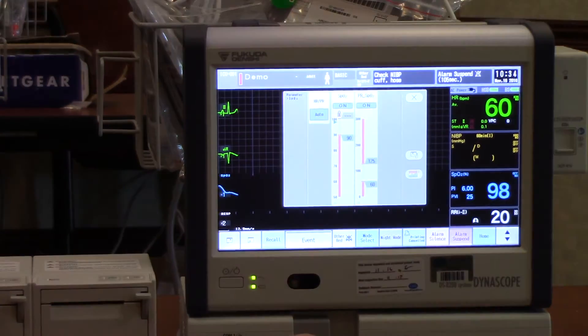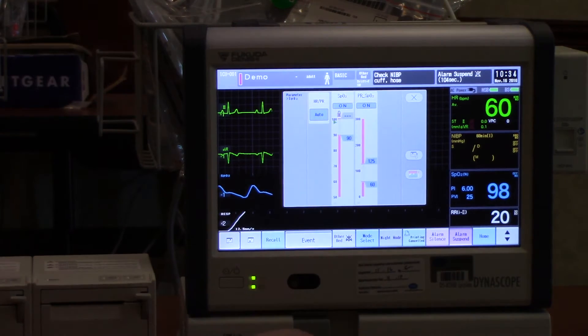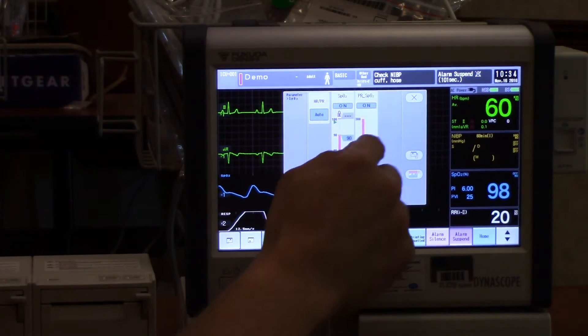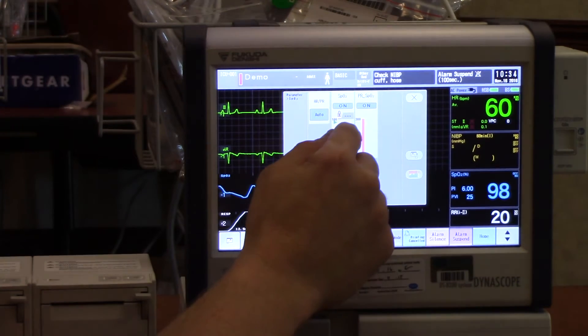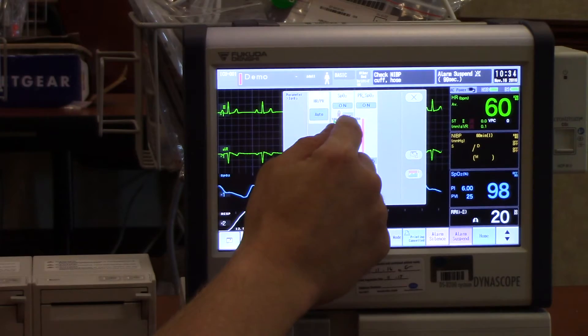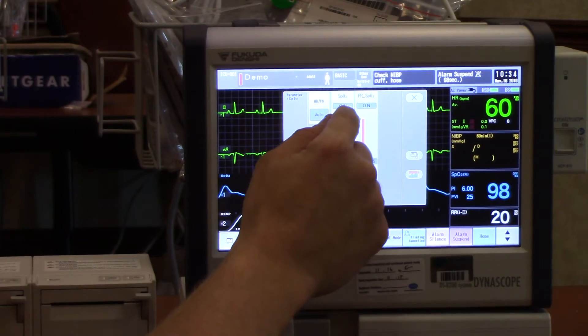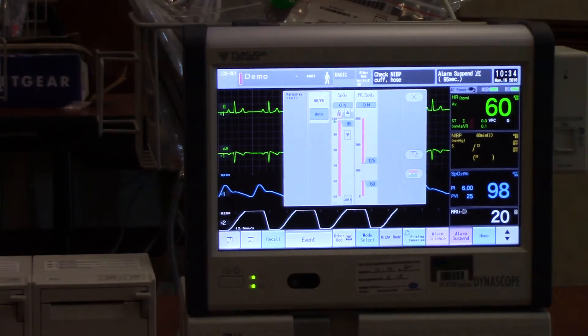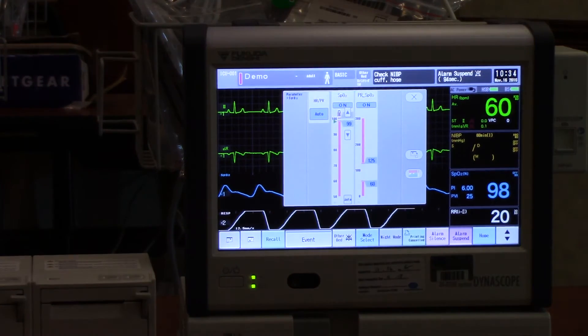For your respiratory alarms — like SpO2, respiratory rate, and end-tidal — your alarms will have a different tone and a blue light on your light bar.